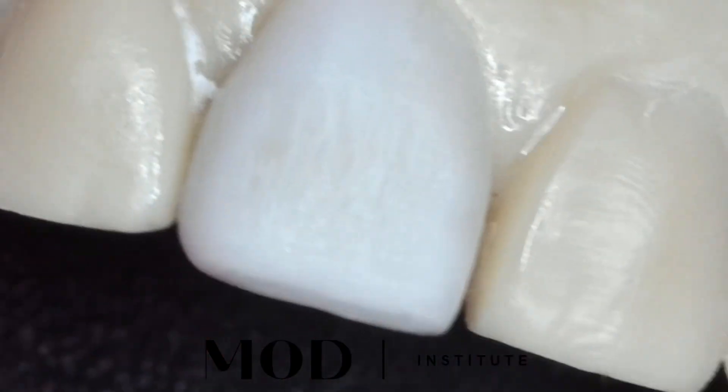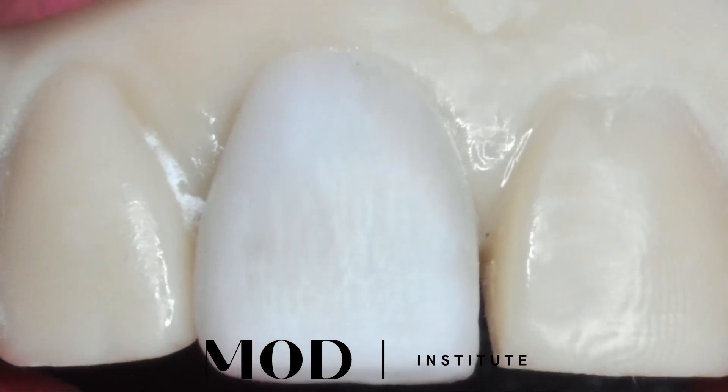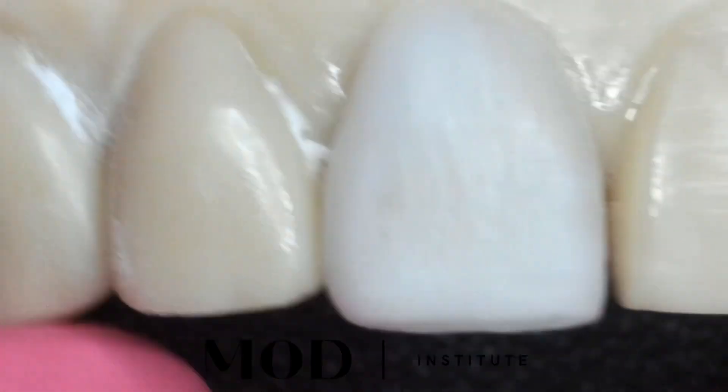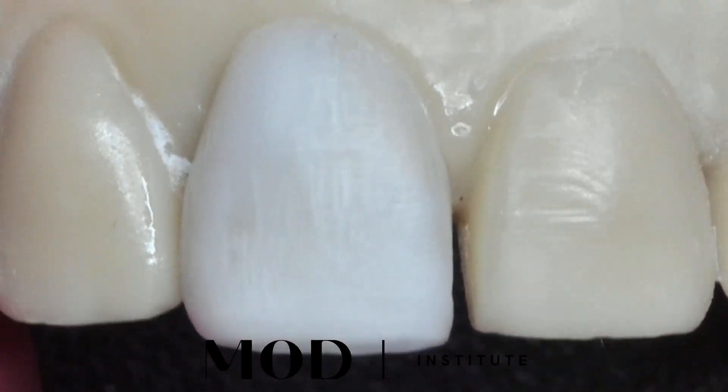Here we can see after it's been finished with the felt, it looks like the perfect fit. There's absolutely nothing more incredible than a printed margin when done properly.